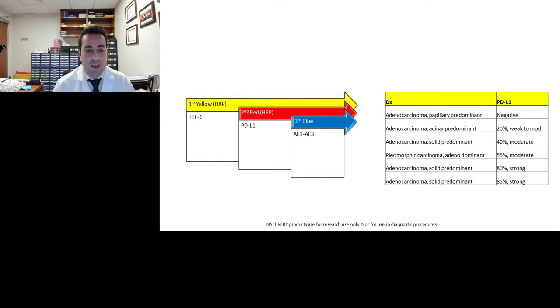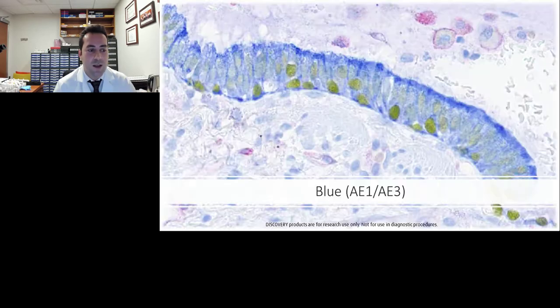As an adjunct, we decided to add cytokeratin as a third antibody in the design. So it would cross-check and enhance the efficacy of TTF1 to detect the tumor cells, creating a discernible transition from nuclear yellow staining to the membranous red staining. We used the same 6 lung cancer cases again for this design.